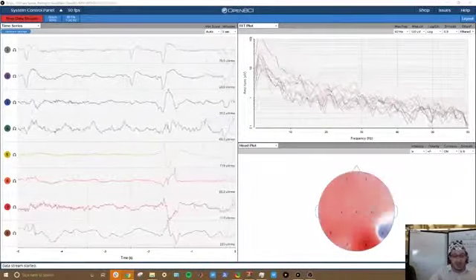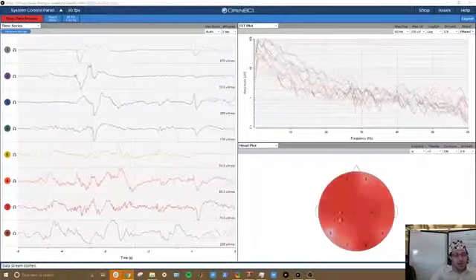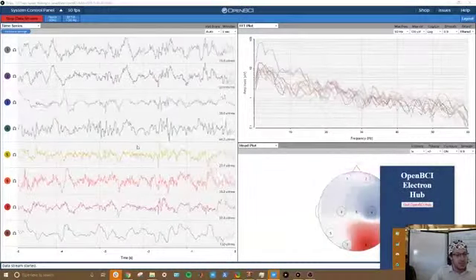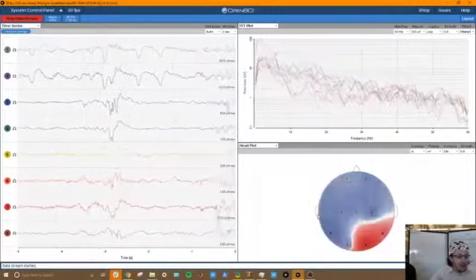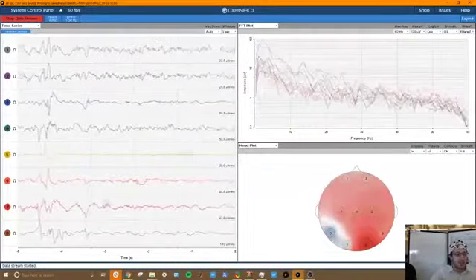To walk you through what's going on right here, this is the OpenBCI GUI, and we have it currently streaming using the OpenBCI Hub. You have to open this first, and then you open this, and that way you won't have a million bugs trying to figure out what's going on. Once you have that working, you can see the streams to verify that you're actually getting data.